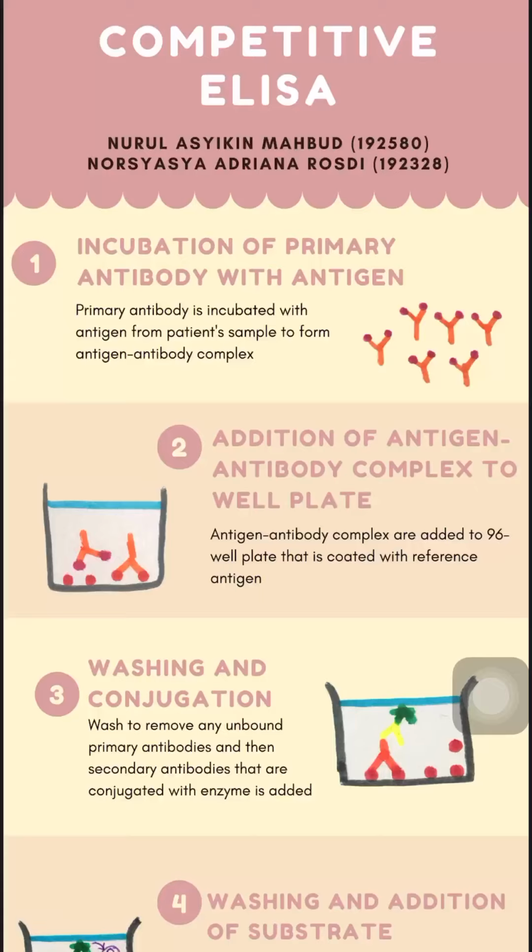Morning, doctor. In this video, I will be explaining the principle of two immunodiagnostic methods, which are competitive ELISA and reverse passive agglutination. But I will start with the first method, which is competitive ELISA.